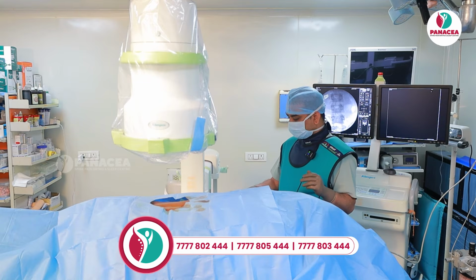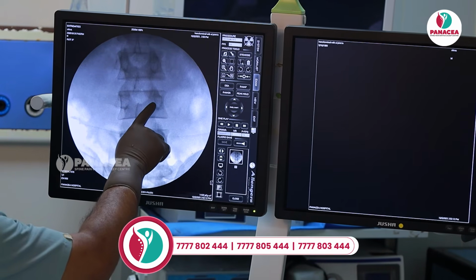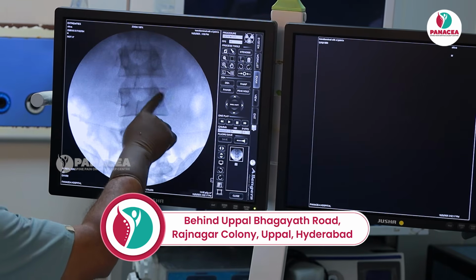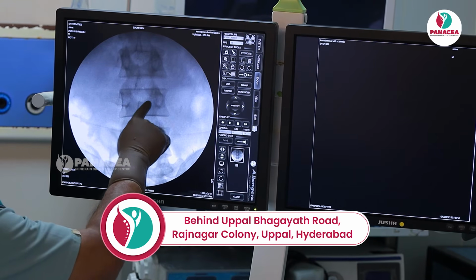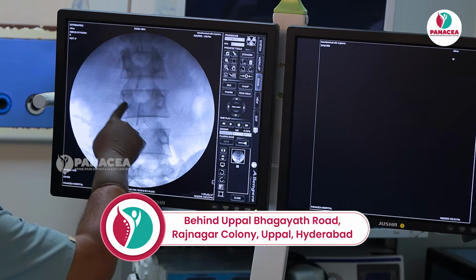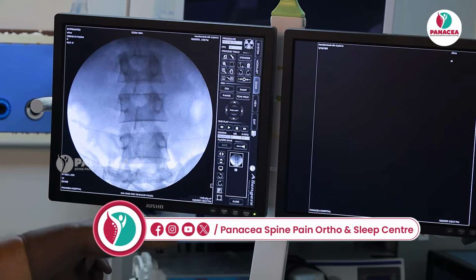Here it is placed at 0 degrees. We are interested in L4 body and L5 body. If you look at the pedicles, the spinous process is not equidistant. On the right side, the distance is more compared to the left side. What does it infer? It infers that the table is tilted to one side.